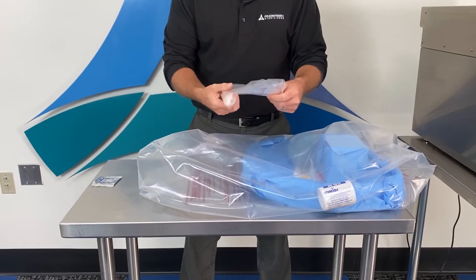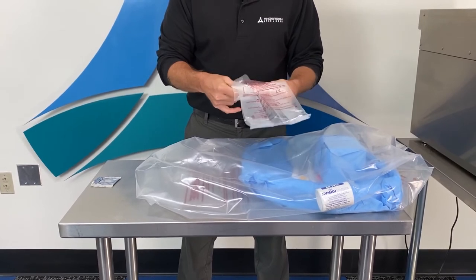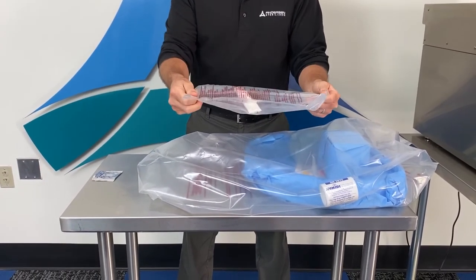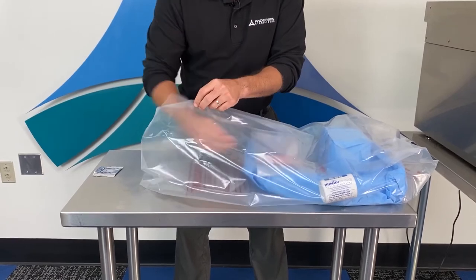And your last item will be your gas ampule. Unroll the ampule bag and move the gas ampule to the center of the bag. Do not open this bag — you'll place it into the sterilization liner bag on top of your items to be sterilized.